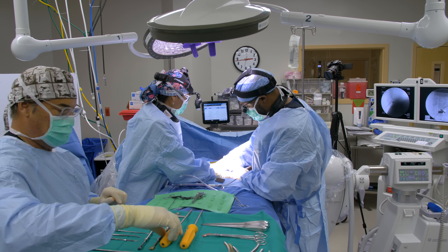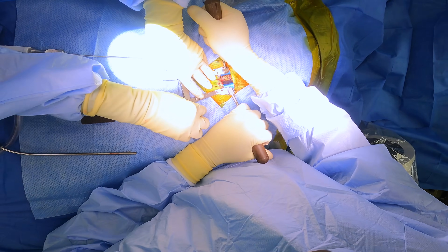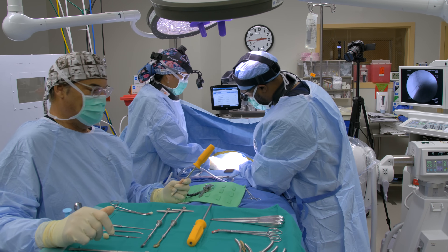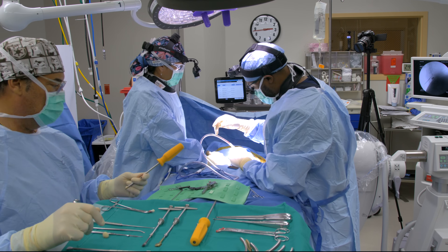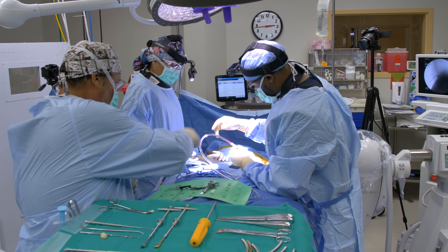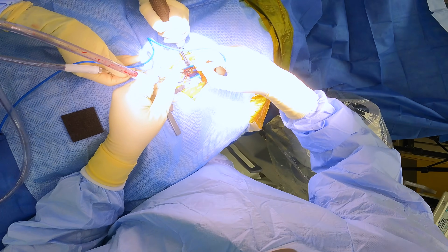Now we're going to the C5-C6 level. This is the level where he has the tightest compression — his nerves are severely tight. He has a C6 radiculopathy, which means he has pain radiating down the arm in a C6 distribution. This is the level where I need to pay attention to the left side, where most of his complaints are.